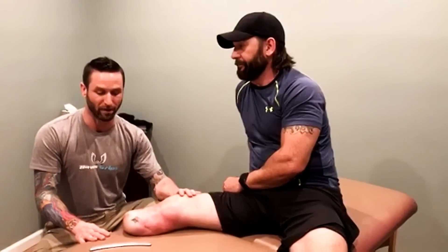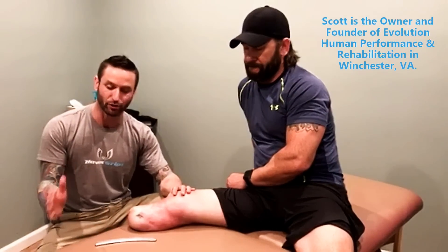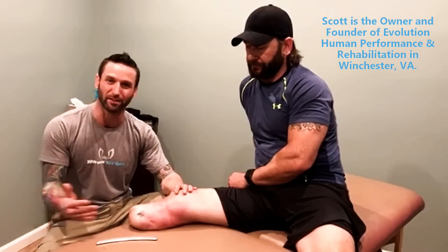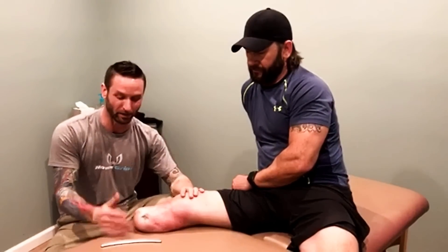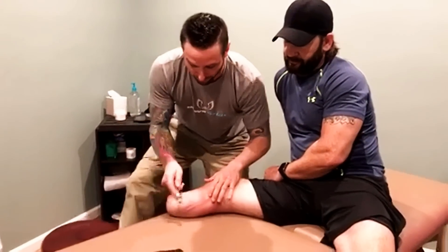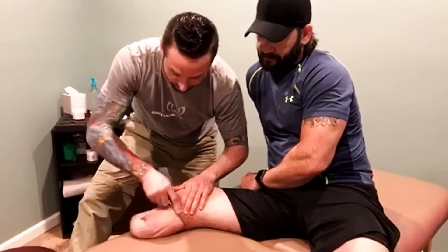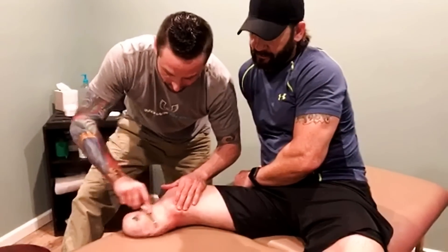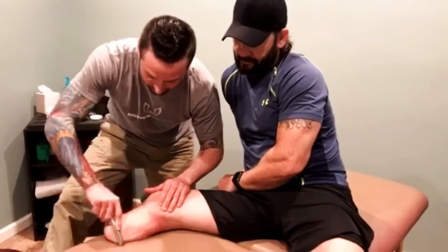It was crazy to be faced with a spasming muscle which we usually stretch, but there's not a joint distal to it to lengthen and stretch this muscle. I'm thinking, how am I going to lengthen the fascia? And really, the tools came in — just using the instruments to work down through what's left of his gastroc and soleus, just letting them get some purchase and go through there.